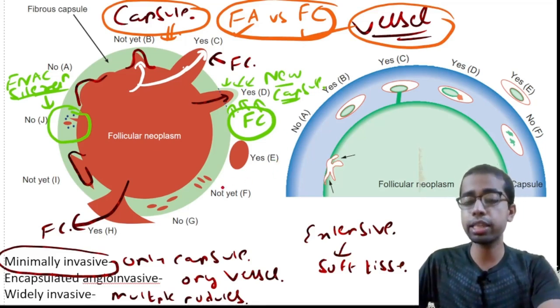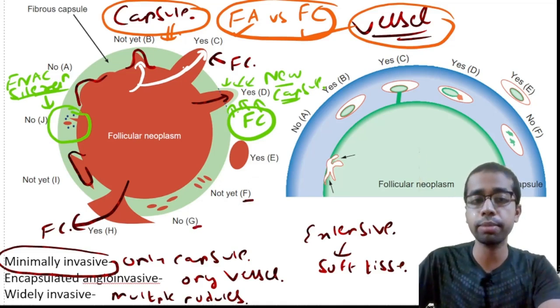But if there are again these two entities, this F and G, please focus on them. In this F and G, wait a minute, yes.